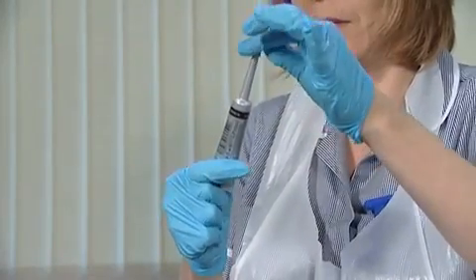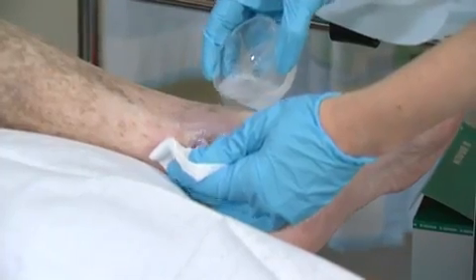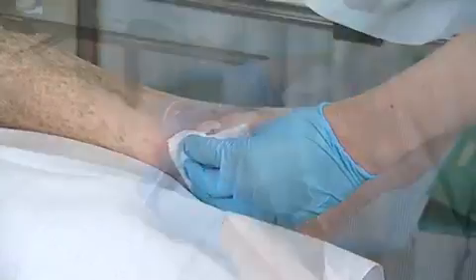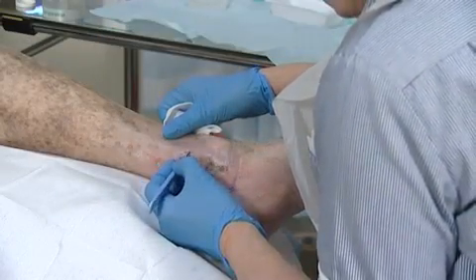The paste is easy to apply and doesn't require any specialist skills. First, irrigate the wound with Prontosan and dry the surrounding skin. If necessary, debride the wound prior to application of the paste.